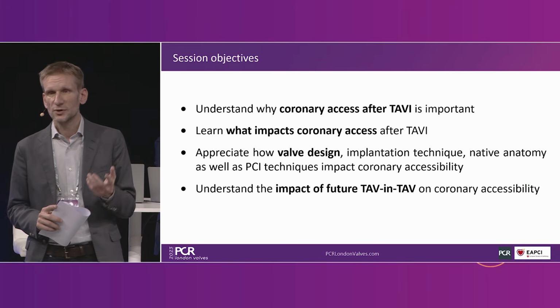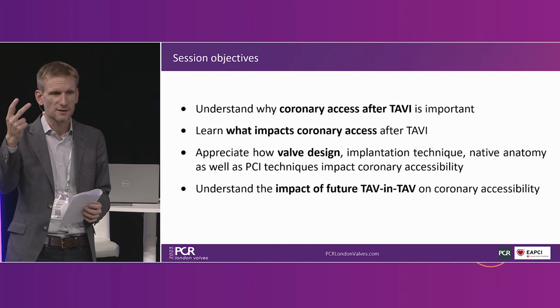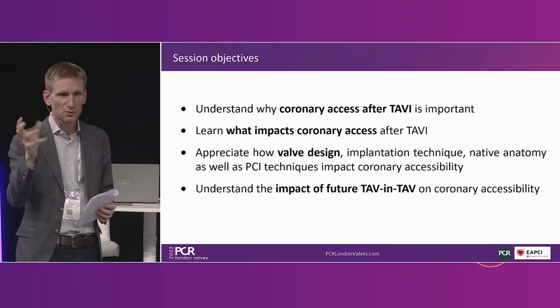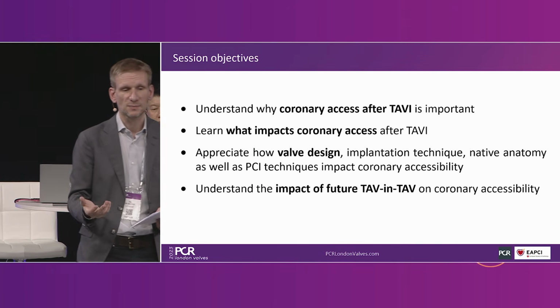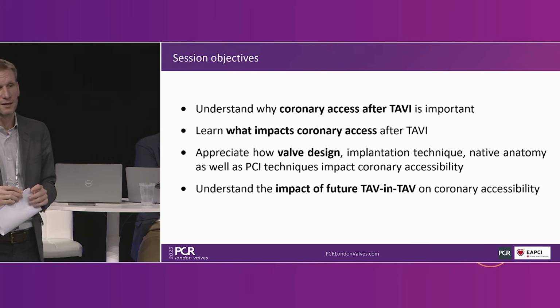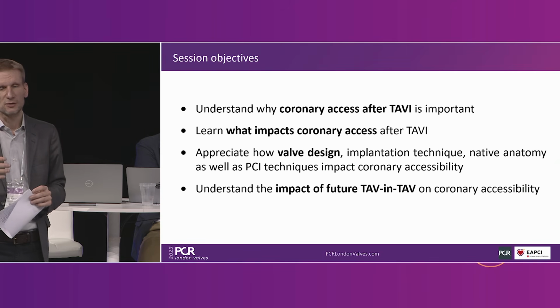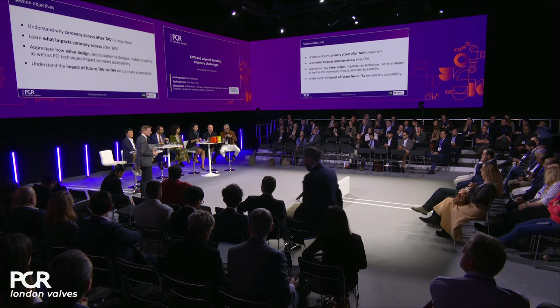We want to know how to appreciate valve design, implantation technique, native anatomy, because those are the three factors that play together. You have valve design, how you implant it, and then the native anatomy of your patient. These three factors decide on the coronary accessibility, and then how to do it, also with some PCI techniques. And then lastly, related with the previous session, understand the impact of potential future TAV-in-TAV on coronary accessibility. So to go straight into the session, Francesca, you can show some case to show indeed the pitfalls of coronary access after TAVI.